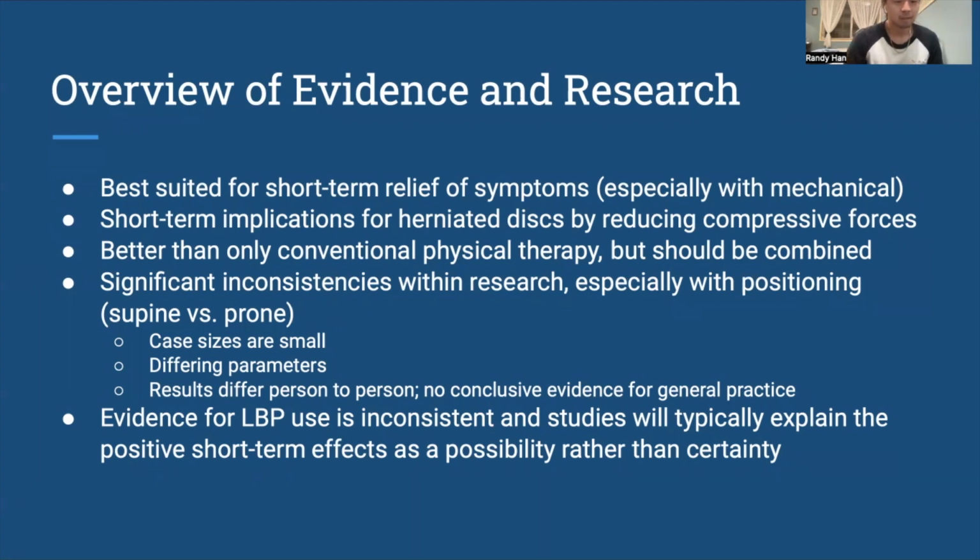There is some evidence for using lumbar traction in regards to lower back pain, but just like with anything else we've talked about so far, it's still pretty inconsistent. The studies will typically talk about the positive short-term effects as more of a possibility rather than certainty. Basically, using traction for lower back pain could possibly help with symptoms, but it ranges from person to person.